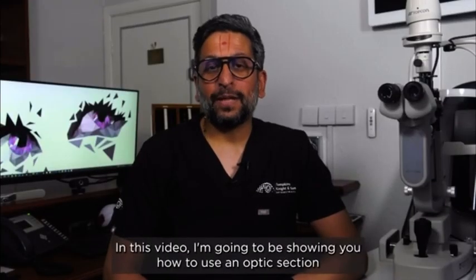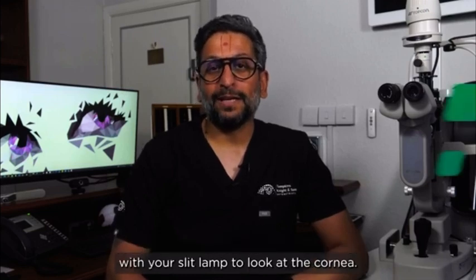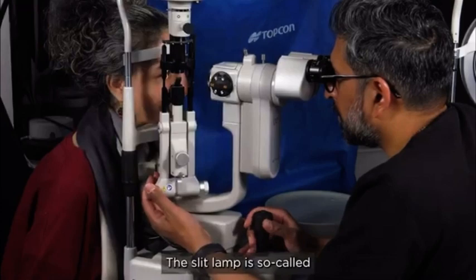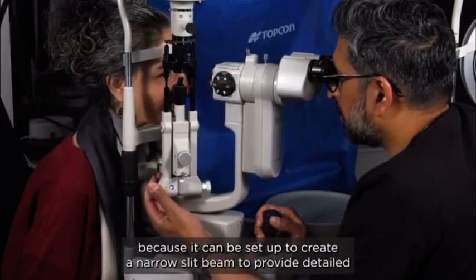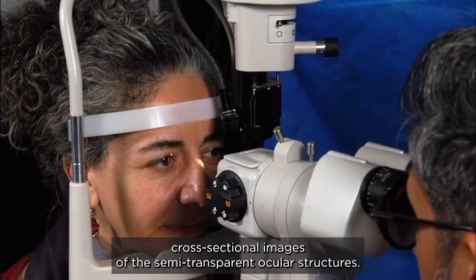In this video, I'm going to be showing you how to use the optic section with your slit lamp to look at the cornea. The slit lamp is so called because it can be set up to create a narrow slit beam to provide detailed cross-sectional images of the semi-transparent ocular structures.